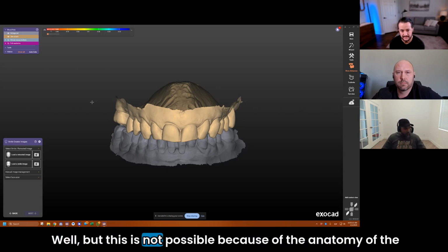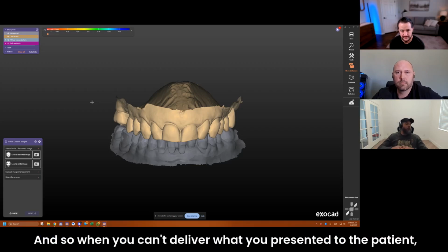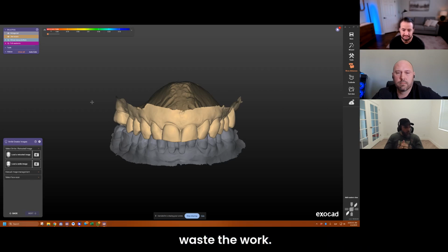Well, this is not possible because of the anatomy of the patient. So how am I going to deliver on this now? When you can't deliver what you presented to the patient, then everyone is mad. The patient is unhappy, so is the doctor, and so are you, because you wasted the work. So that would be my take on the whole situation. Okay. Let's keep going.